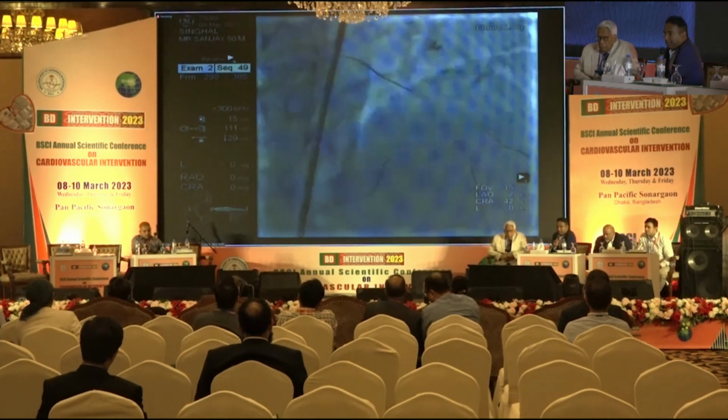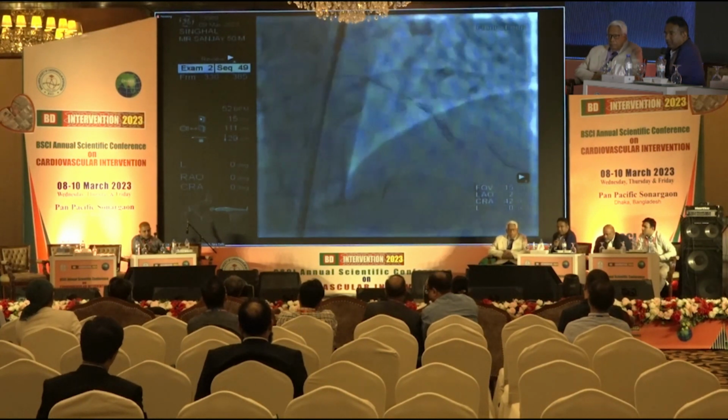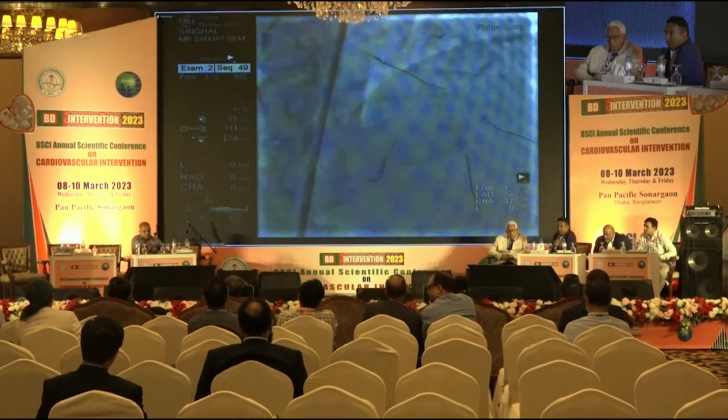Sir, is it the septal, this one? No, the septal is already crossed and dilated, so we have that flowing. You try now to, it is the diagonal, as you can see.